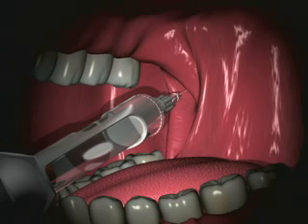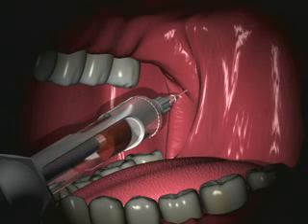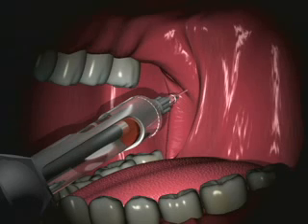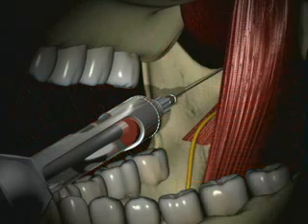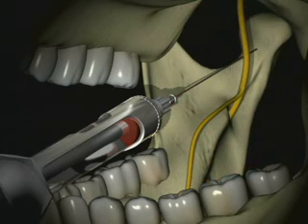Once contact is made, the needle should be withdrawn 1 millimeter and the full cartridge administered following a negative aspiration. It is important to note that if bone is not contacted, one should not inject but redirect until the neck of the condyle is contacted. The injection site is bounded by the medial pterygoid muscle and the sphenomandibular ligament medially, the lateral pterygoid muscle superiorly, the ramus laterally, and the neck of the condyle posteriorly.